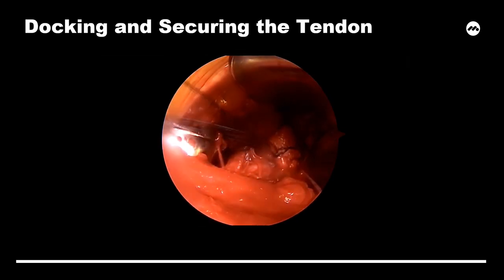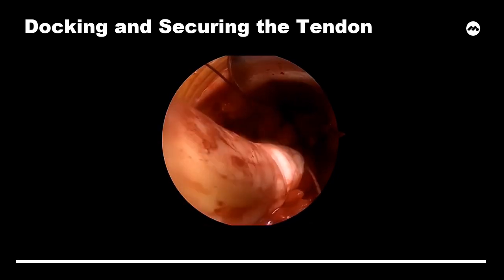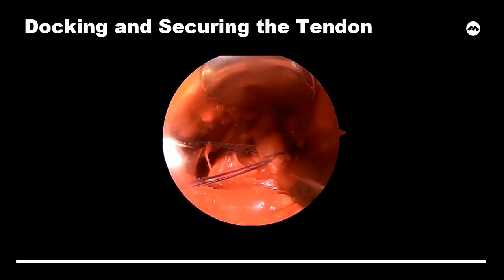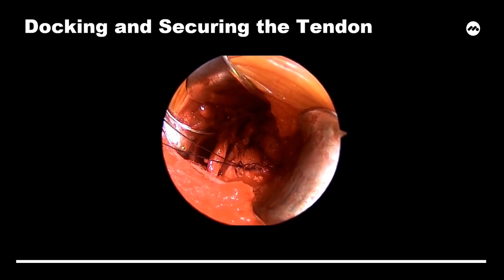It is critical that the knee is held in 45 degrees of flexion during tying. Care should be taken to lay each knot securely with the tendon reduced. In deep surgical fields, the surgeon may also consider using a knot pusher for assistance. The suture strands are cut above the knot with either a deep knife or knot cutter.